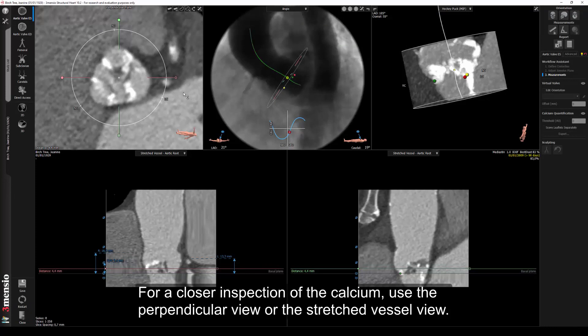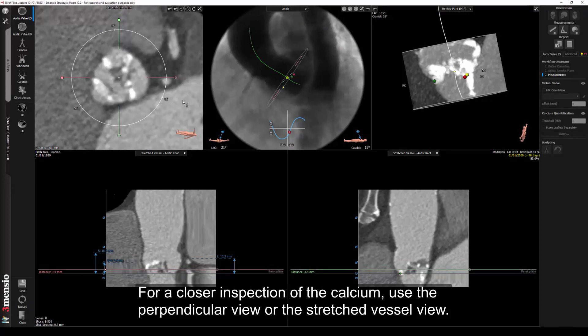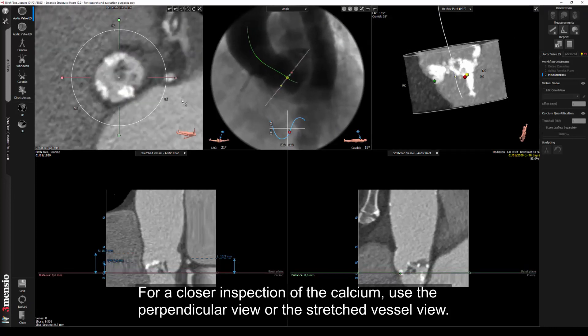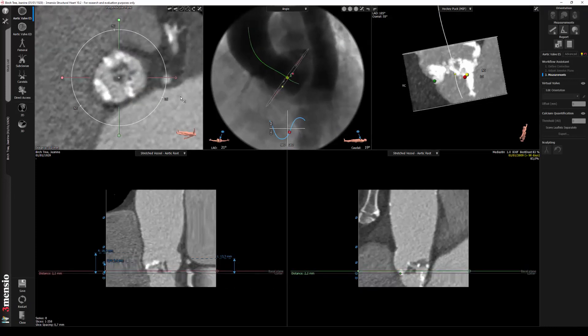For a closer inspection of the calcium, use the perpendicular view or the stretched vessel view.